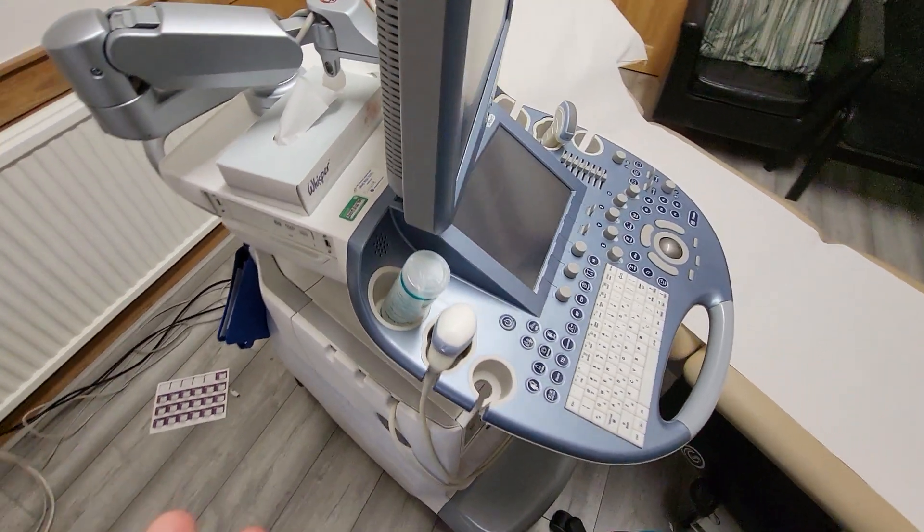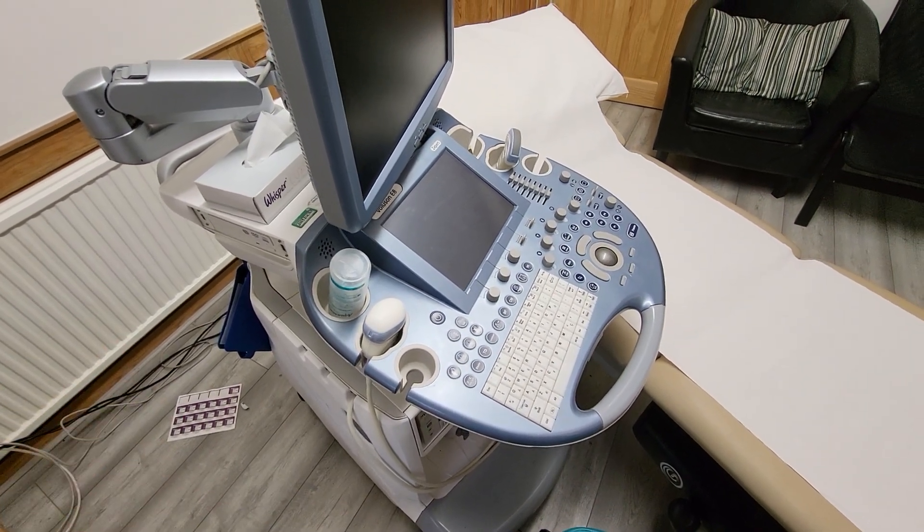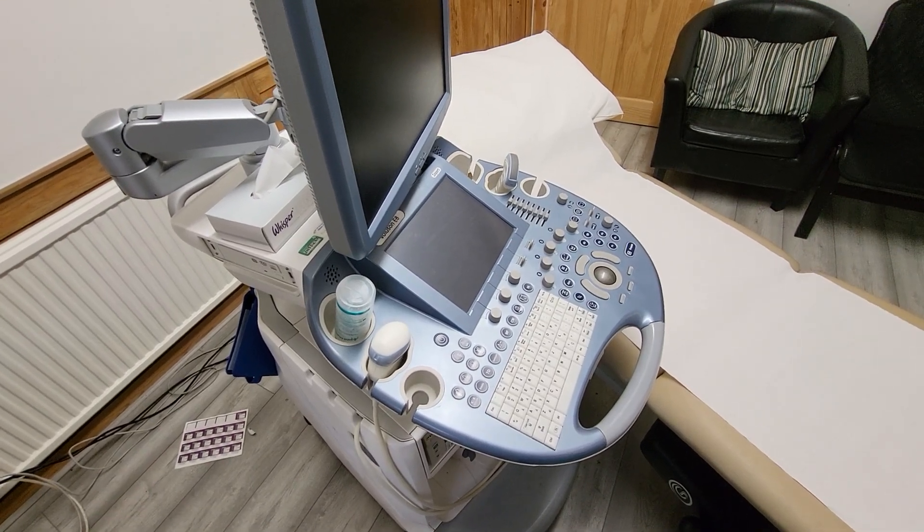Seaward sell a medical PAT Testing machine. If you go on the website, you can have a look about it, have a read up about what a medical PAT Test is. But it works to a completely different standard.